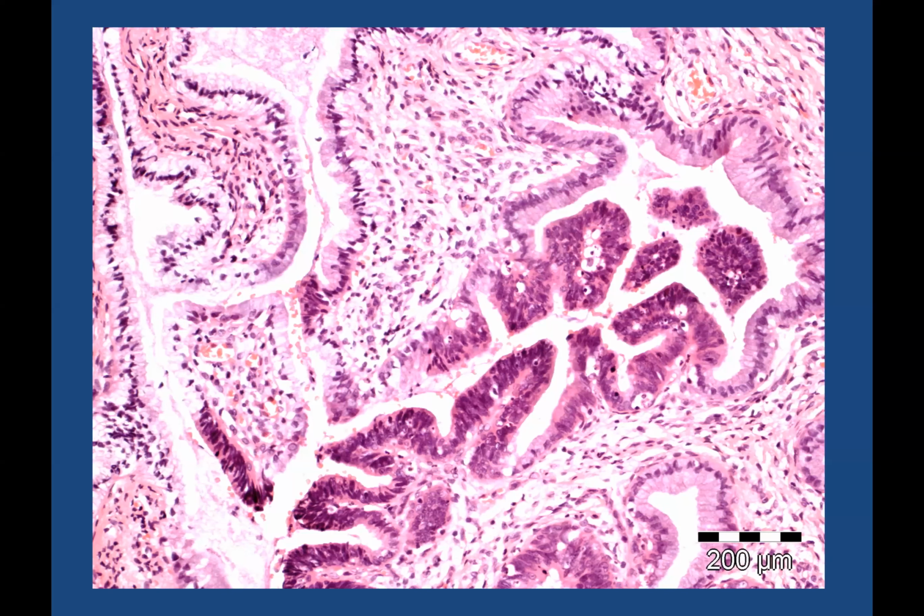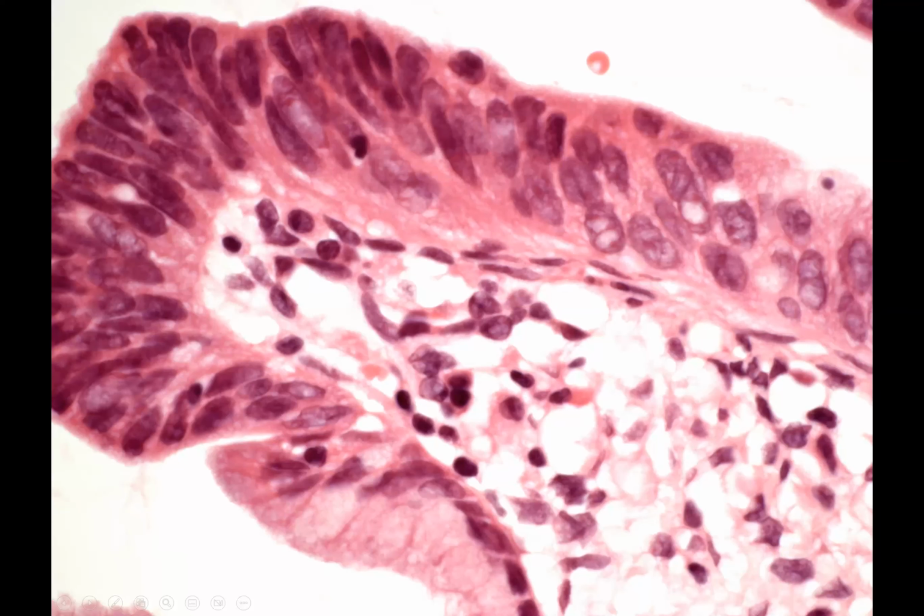Here, this is something that's abnormal, and your eye is drawn, even at low power. You can see that we have areas such as this which stain much darker than the background endocervical crypts. And of course, we can see that there's an abrupt transition between what looks to be normal and something that looks more interesting. On a higher power now, you can see why it looks darker.